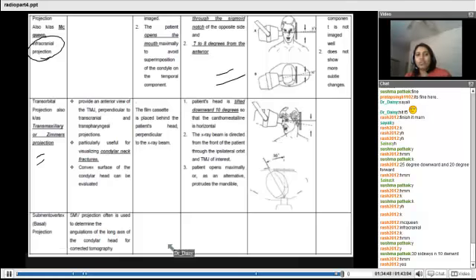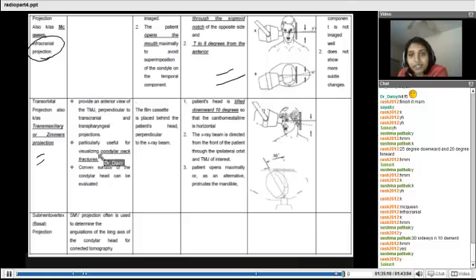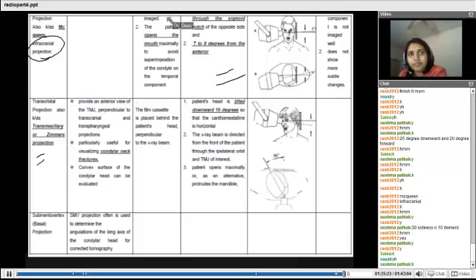And then we have the submental vertex. We already know how the submental vertex is taken, and it is used to see the angulation of the condylar head, and also for the zygomatic arches if they are displacing inwards or interfering with the TMJ. Right? These three views are very important, and a little cumbersome to remember. The best way to deal with them is the diagrams. So look at the diagrams nicely. You should be able to deal with these things.